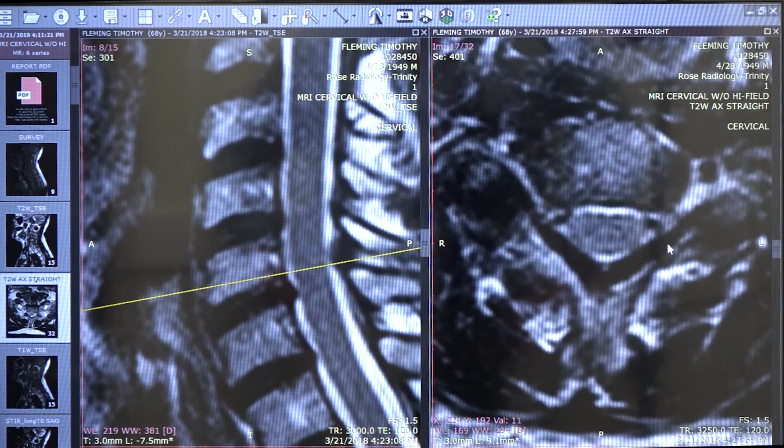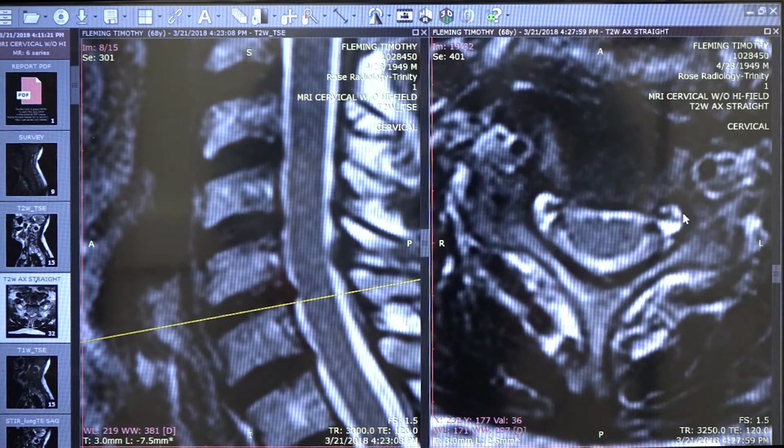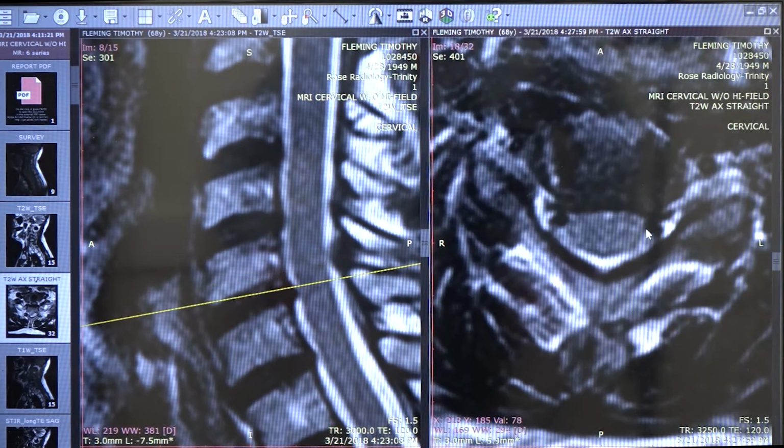Moving down to the 5-6 level, however, this is where the real problem starts. There is a severe narrowing on the right side at that C5-6 level, more so with a diffuse disc herniation that is compressing the anterior margin of the spinal cord, and it narrows the exiting nerve root. So I expect him to have symptoms in the C5-6 area, namely in wrist turning, twisting, and numbness along the base of the thumb and base of the index finger and the first web space. Typically, they also have decreased vibratory appreciation in this area. The fact that he also has disc herniation extending to the left side would make me believe that he would have some symptoms also to the left side.